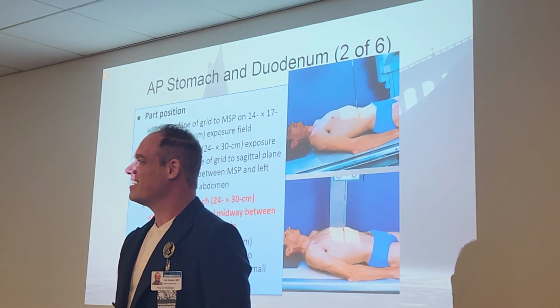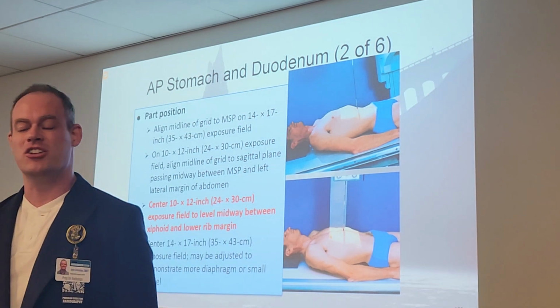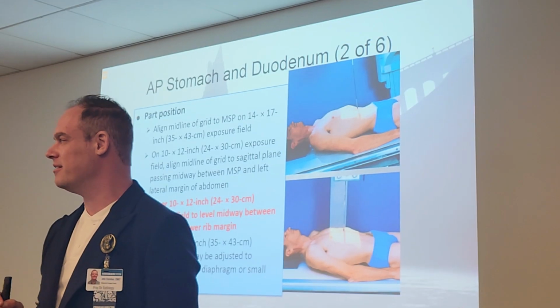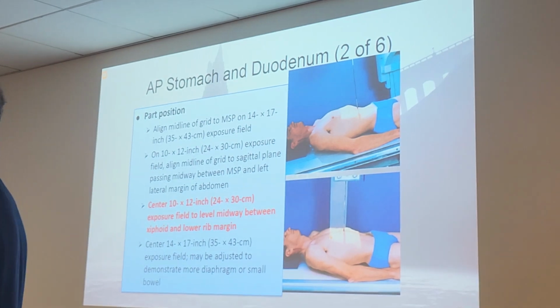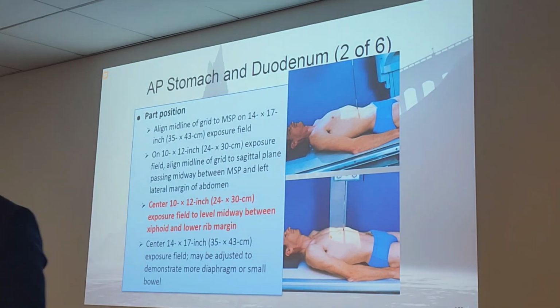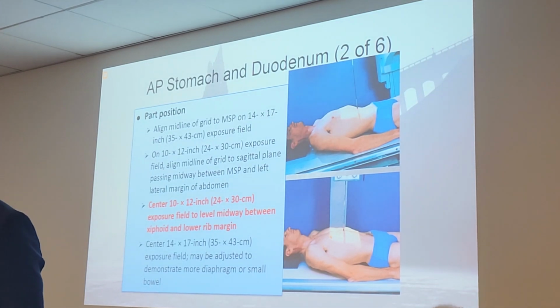The centering for this one is going to share the centering with the LPO. We're centering halfway between the lower rib margin and the xiphoid again for the AP supine. All that is just fine tuning for your cassette sizes, guys, but I want y'all to focus on that centering point. That's the main piece of info on that slide. That's both for Trendelenburg and regular AP, by the way. Centering is the same.